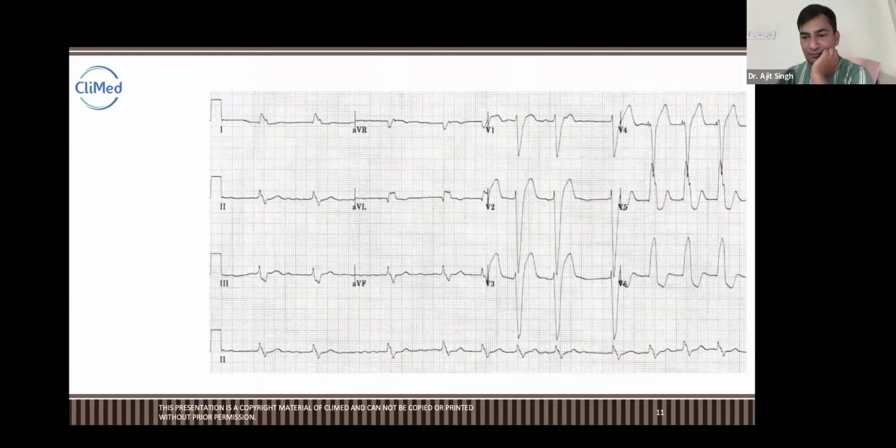Tell me, what is this, guys? Bhavika, V1 was M, V6 was, yeah, V1 was W and V6 was M. Now you edited, okay. V1 is W, Bhavika, you have written wrong. V1 is W, V6 is M. Okay.